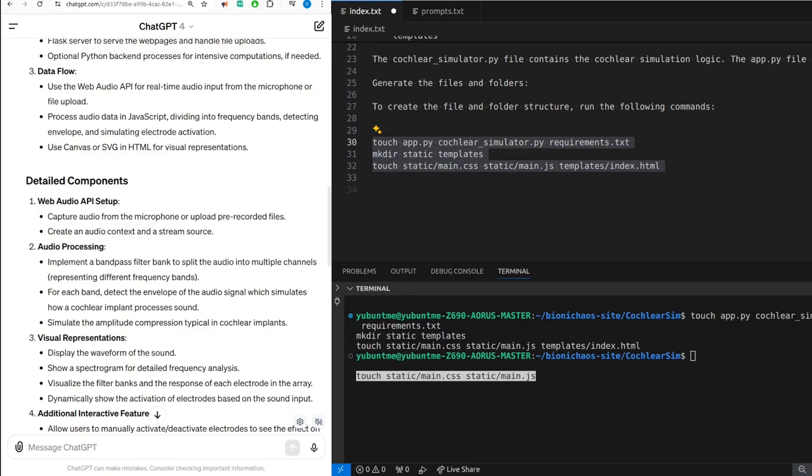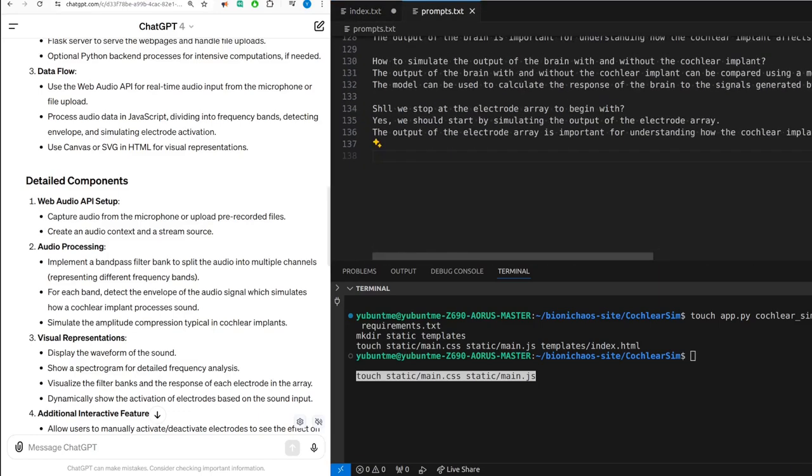Show a spectrogram for detailed frequency analysis. Visualize the filter banks and the response of each electrode in the array. Dynamically show the activation of electrodes based on the sound input. 4. Additional interactive features: allow users to manually activate or deactivate electrodes to see the effect on the processed sound.